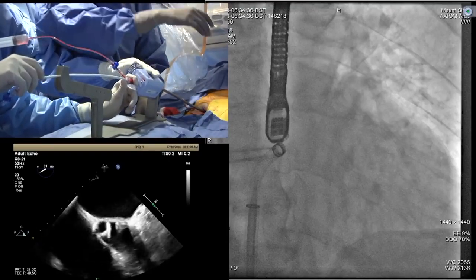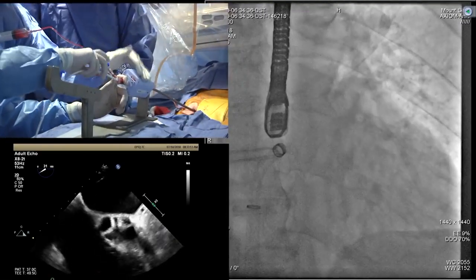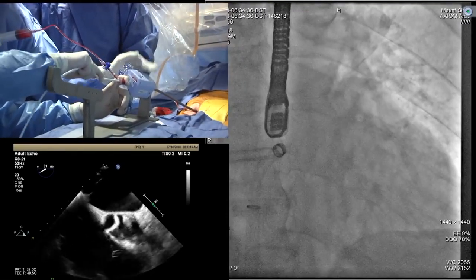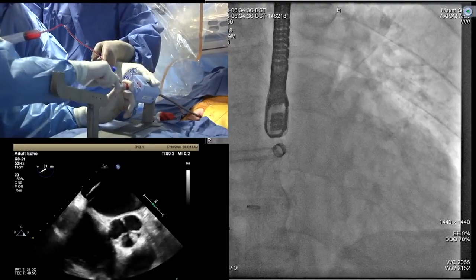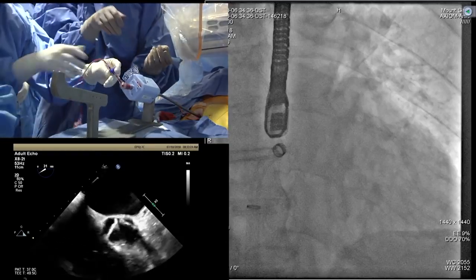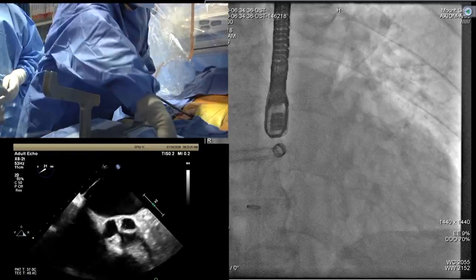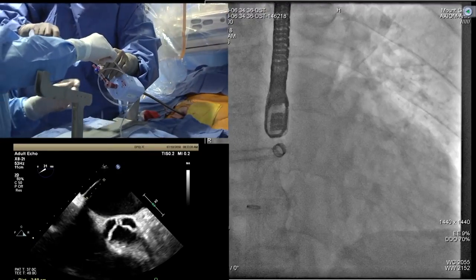You cannot have air being sucked in. So what happens is everything is coming out. See that? You still keep tapping and withdrawing. Good. Now you flush, so there will be no air bubble or anything going in. Give me a bigger flush.